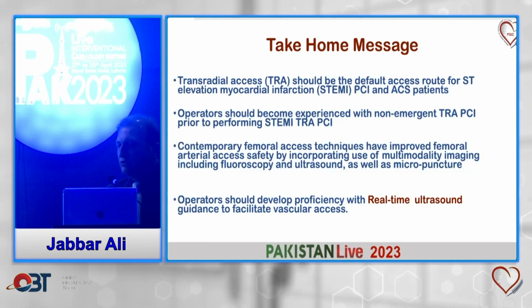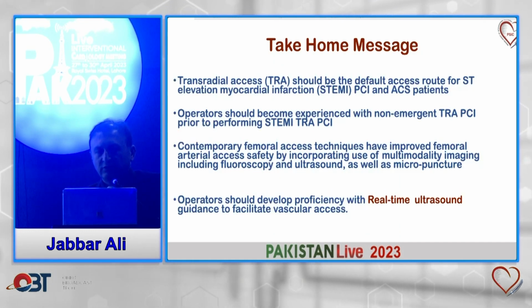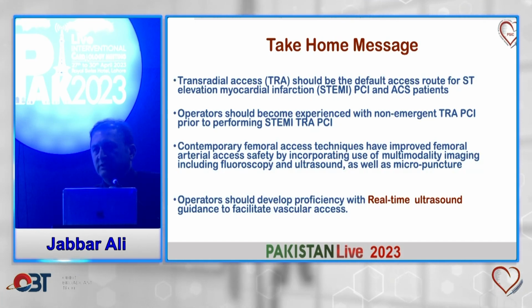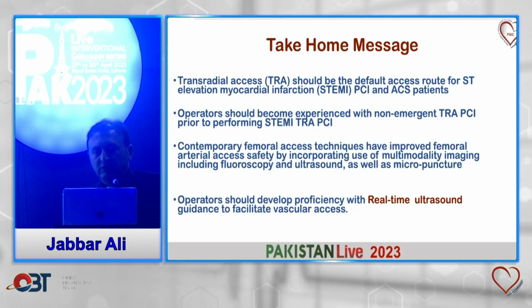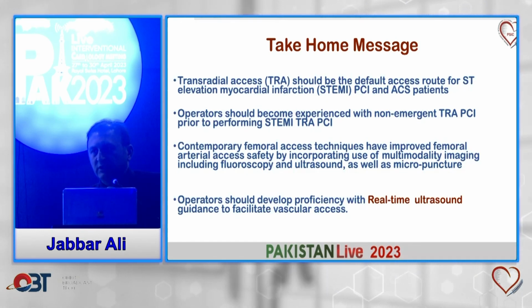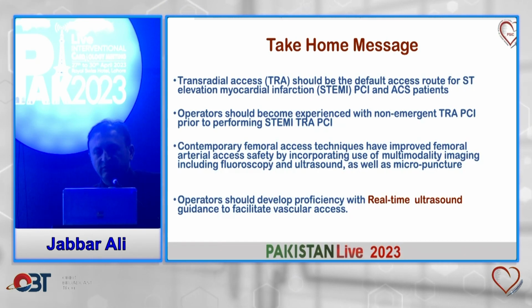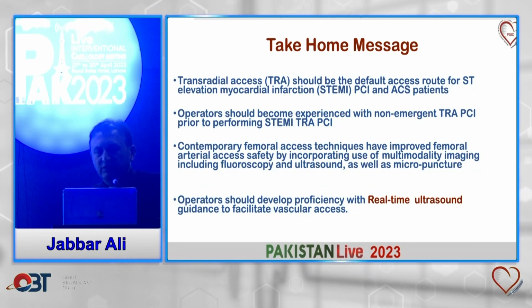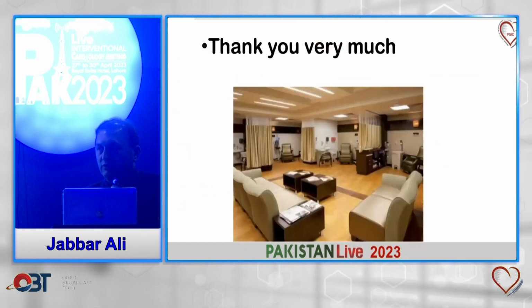Transradial access should be used in any acute coronary syndrome patient, but the operator has to be trained first in non-acute coronary syndrome cases. Contemporary femoral access, if you are using ultrasound, is safe. Operators should develop proficiency with real-time ultrasound guidance to facilitate vascular access. Thank you very much.